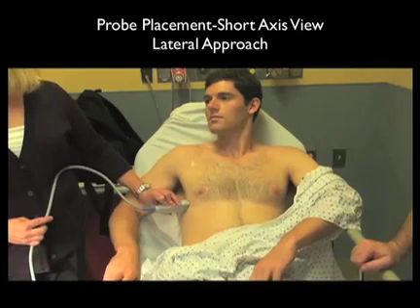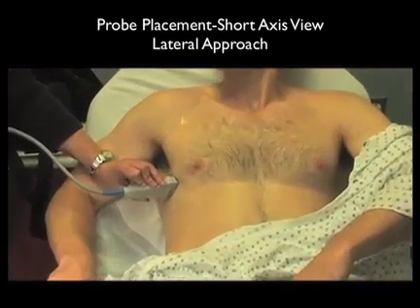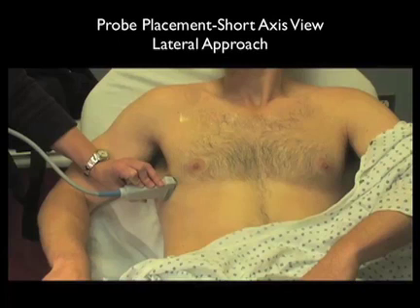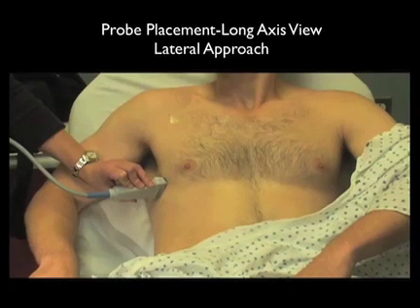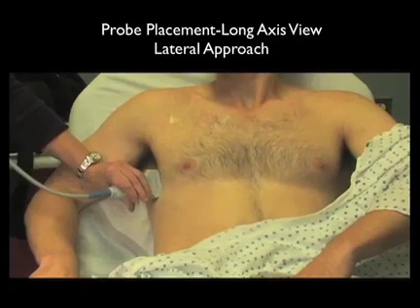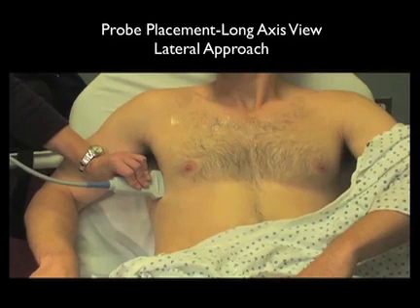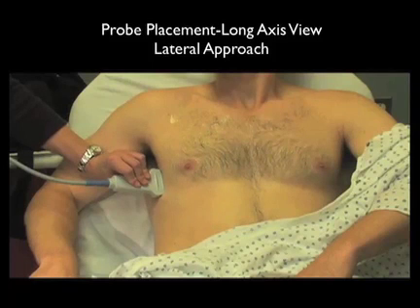If no lung is seen on the anterior chest wall, one can size out a pneumothorax by looking in the lateral positions as shown here. Notice the probe on the lateral chest wall in the short axis configuration between the ribs. If lung is seen here laterally but not anteriorly, this would tell you it was an incomplete pneumothorax. We can complement the short axis view by locating the probe into the long axis configuration with the marker dot towards the patient's axilla to further examine into these lateral areas of the chest wall.